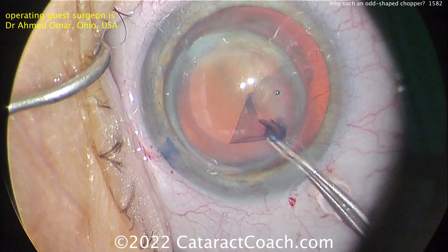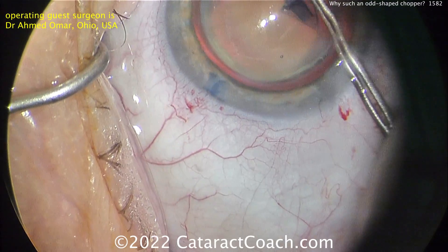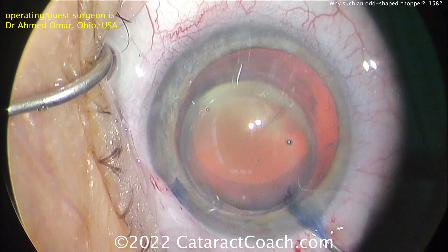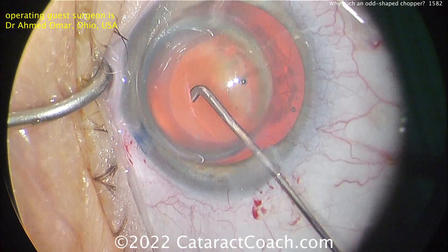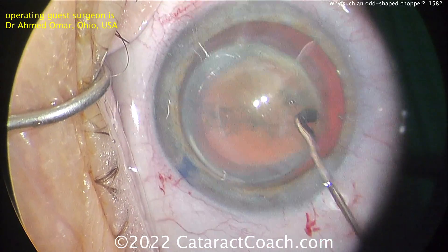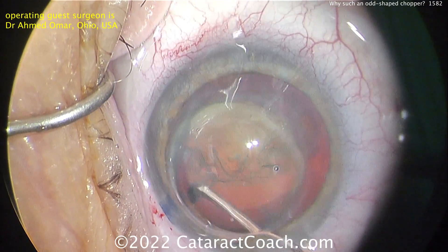The capsule has been stained with Tri-Pan Blue Dye, getting that rhexis done. And as the rhexis goes around, you're looking here — what is that on the cornea there? That big central bulbous-looking structure? Of course, the patient had a prior penetrating keratoplasty, or corneal transplant. The patient had been seeing pretty well for many years, until the cataract developed. And so now it's time for cataract surgery.